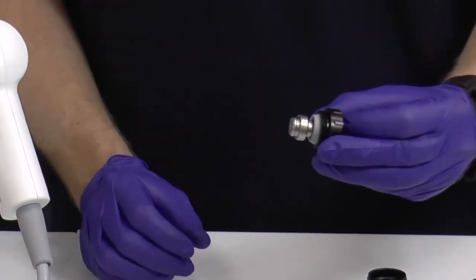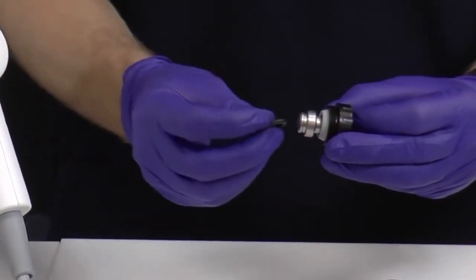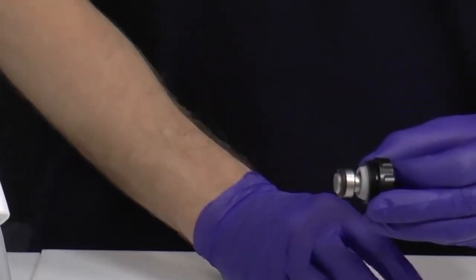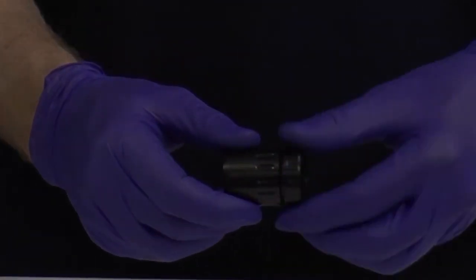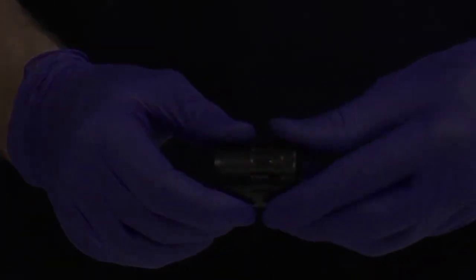Put the 12 by 3 mm O-ring onto the rear part of the pin. Screw on the rear part of the cap by tightening it until it stops. Leave the transmitter for mounting onto the applicator later.